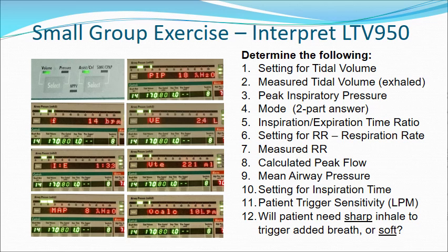And now I'll mention that each one of these pictures is the same mode, so it just flashes different readings, and I've captured those by camera, and that information is what you need to use to resolve the 12 questions. The instructor can freeze the video at this point and give you adequate time as a group to come up with the answers.